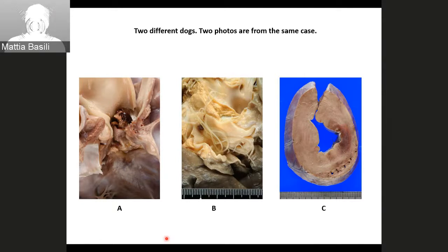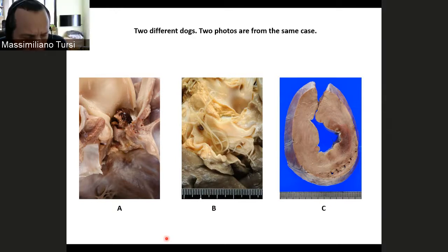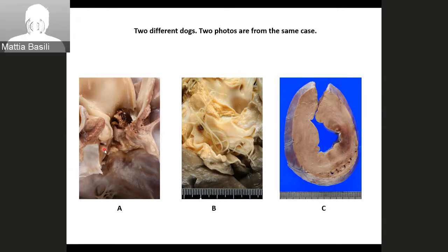Anyway, most likely, as I said, it's going to be widespread. Yeah, that's the main focus, of course. There is an endocarditis, aortic endocarditis, and so there is an involvement of the Valsalva sinus, and so an embolism of septic emboli in the myocardium. That's a septic infarct, of course. Okay, nice. I missed the infarct a bit.